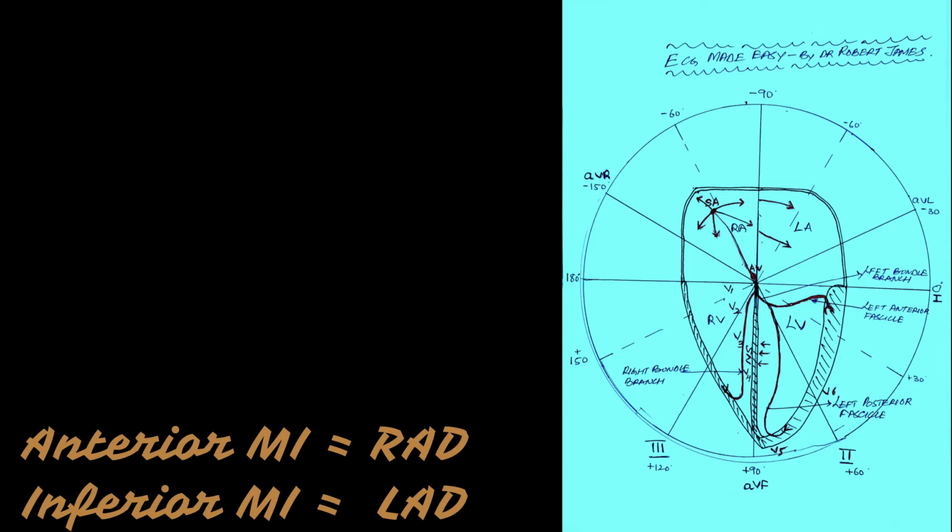So axis is so important. That is why always when you look to interpret the ECG, rate, rhythm, axis. Never bypass these steps, and you will not miss an MI also. Okay, so now we come to the ECG findings in acute myocardial infarction.